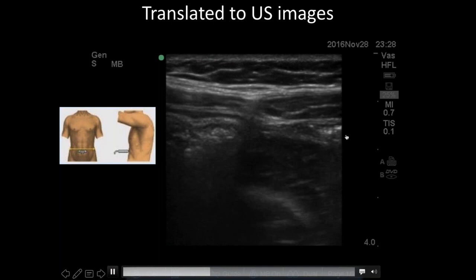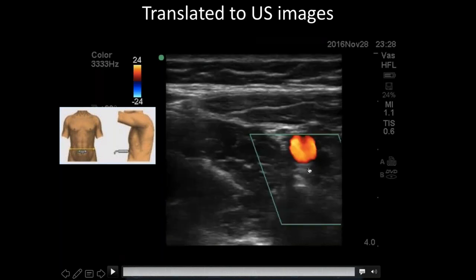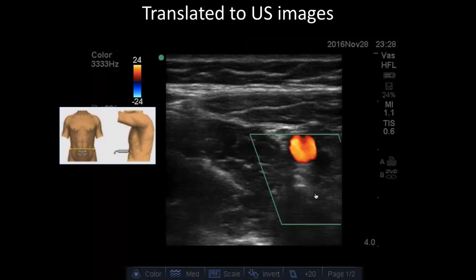Large bowel, psoas. This area here is all small bowel, and then as compression goes on, boom, it brings in that small bowel, and it's kind of over that iliac vessel. We're going to have to prove that this is iliac vessel, so I usually put some color Doppler to make sure that I'm happy that this is iliac vessel. And then, like I was saying, rectus abdominis, it's right up there. See how close everything comes together when you're putting compression.